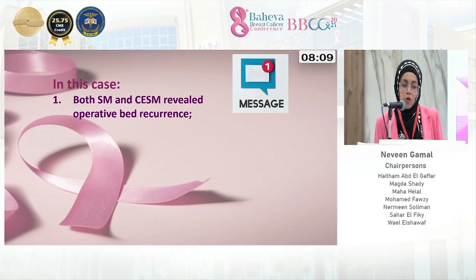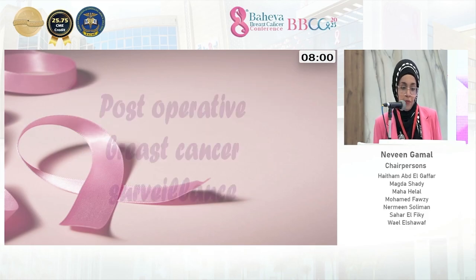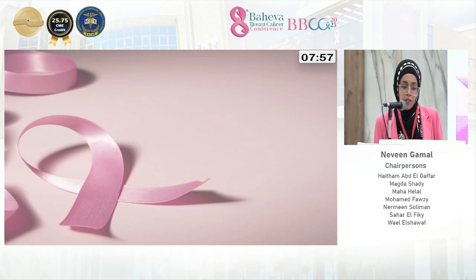In this case, both sonomammogram and contrast revealed operative bed recurrence. However, sonomammogram couldn't detect the contralateral newly developed lesion, which was detected by contrast. So, post-operative breast cancer surveillance.